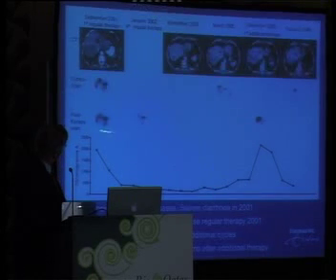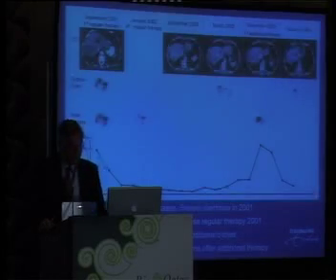You see here the effect after 4 doses. That is the tumor marker going down. You see here a nice improvement in this case on the CT, as well as the post-treatment scans. Here there is a relapse shown here on the CT scan. Finally, the patient here decided indeed to get additional treatments. He got 2 extra cycles, and here in February, you see the decline in chromogranin and improvement in the CT.